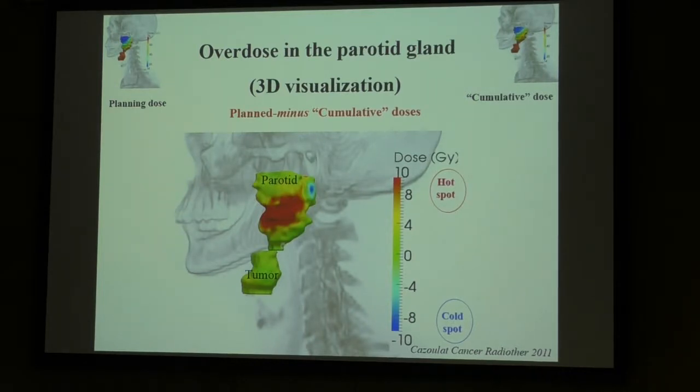It's a good question. Actually, at the beginning there is really an inflammation reaction, and the parotid gland may even increase a little, and then decrease. I don't know exactly. Is it normal for parotids to decrease during treatment? It normally decreases, yes. On average, it decreases by 30%, depending on the patient. It can be more or less, but this hotspot is not only due to the parotid gland shrinking. It is also due to the tumor shrinking and weight loss and so on.